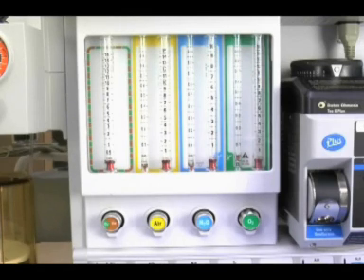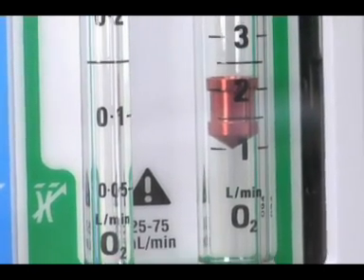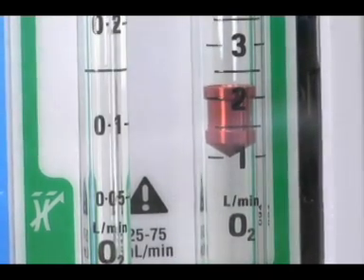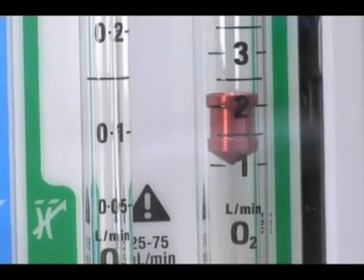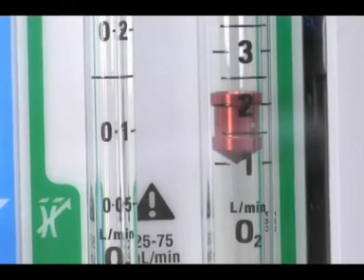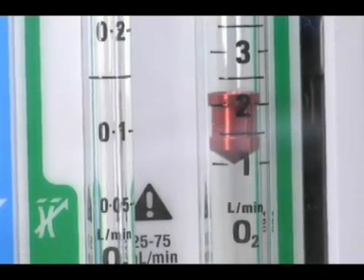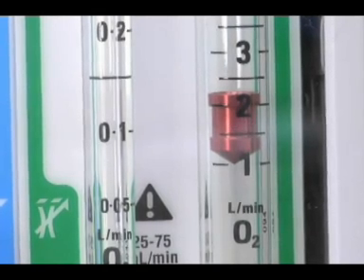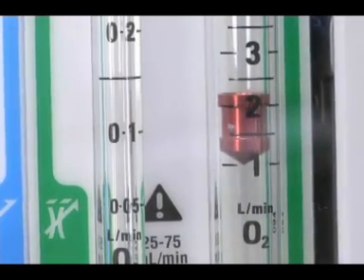Flow meter. There are two types of flow meters: constant pressure variable orifice or electronic. The anesthesia machines used at KU have the variable orifice, in which the ball, bobbin, or float is supported by the flow of oxygen through a tube, known as the Thorpe tube. Each flow meter assembly consists of a flow tube, float, flow tube filter, and float stops.